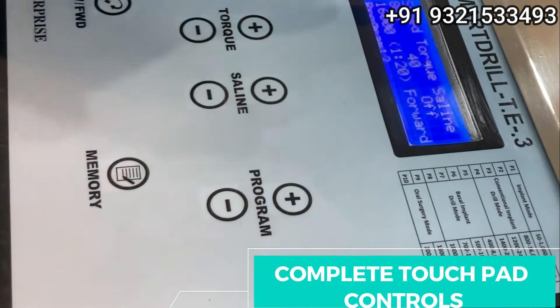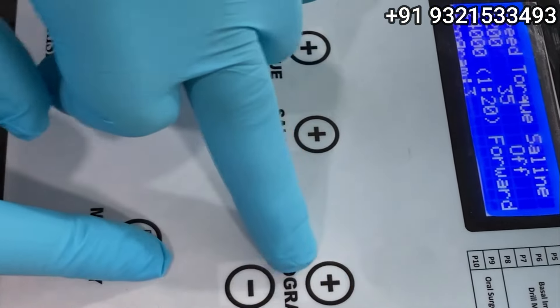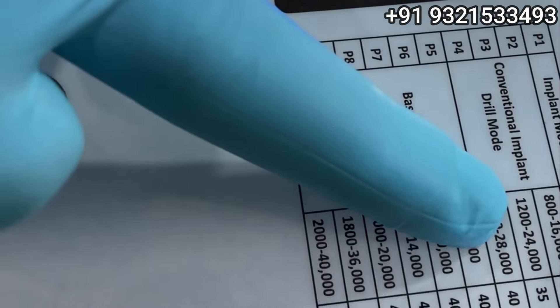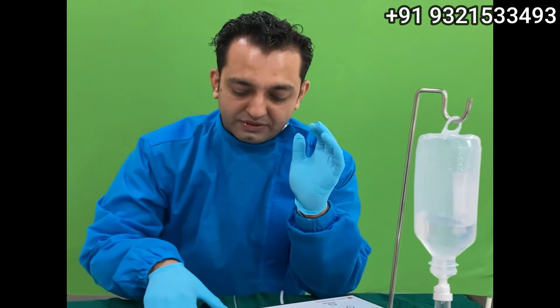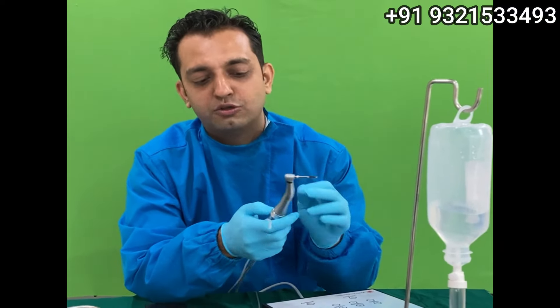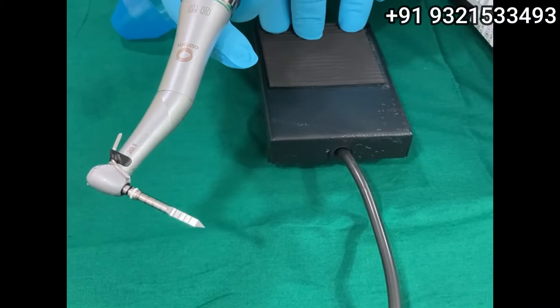When it comes to the programs, you can see P2 is written here. If I press this program button, it becomes P3. In P3 you get the speed as shown — and here is another wonderful feature. You can see two speed values: 1200 and 24,000. This is probably the first time ever this machine has AutoSense technology. For conventional implants we use the 20:1 handpiece — the green ring handpiece — so you get 1200 RPM in P3 mode.